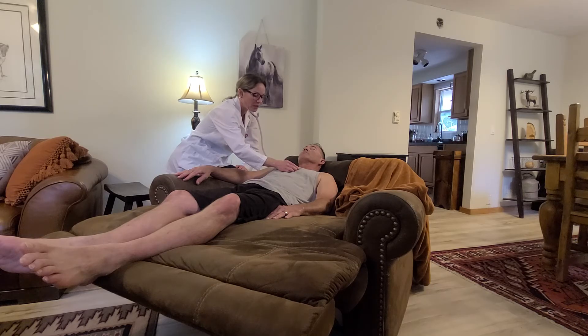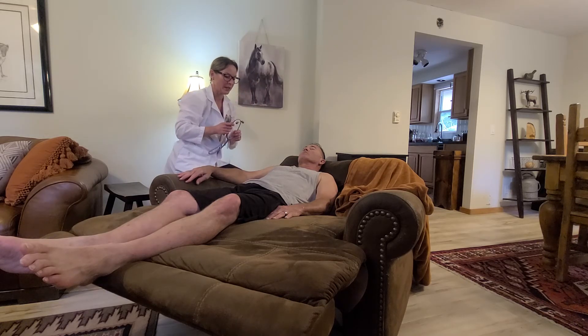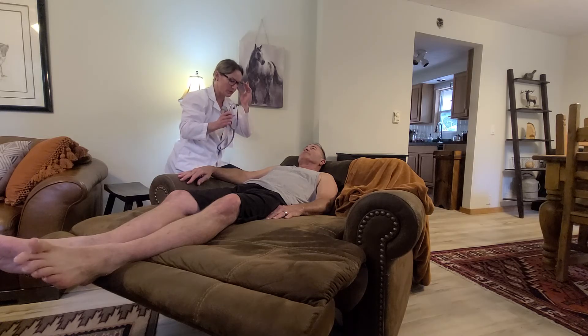I'm going to auscultate in the third intercostal space — Erb's point, left of the sternal border — with the diaphragm and the bell. I do not appreciate any murmurs, clicks, friction rubs, or gallops. Then I'm listening in the fifth intercostal space, mid-clavicular line — the apex of the heart, point of maximum intensity — with the diaphragm and the bell. Again, I do not appreciate any murmurs, clicks, friction rubs, or gallops. I do hear S1 and S2, and there is no S3 or S4. Those are all normal findings.